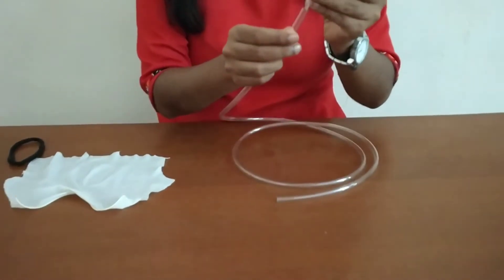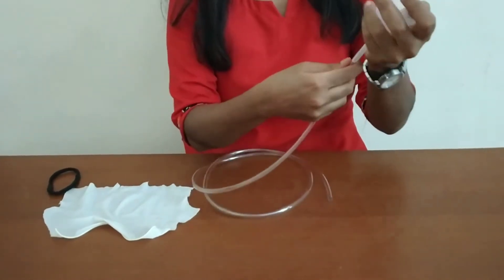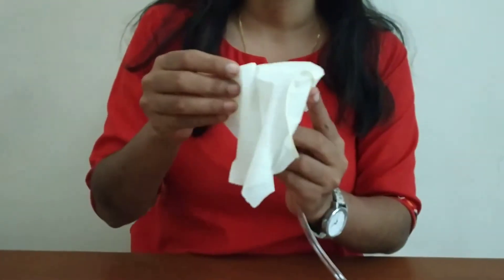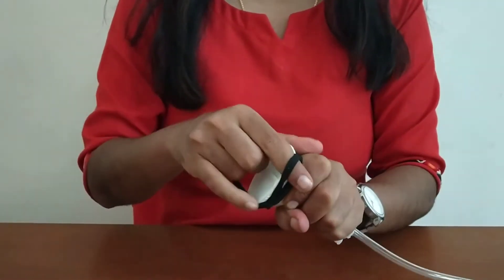First we are going to take the funnel and put it into the tube properly. Insert it properly into the tube. Then you are going to take the balloon rubber and place it on the funnel, and then tie it tightly with the rubber band.